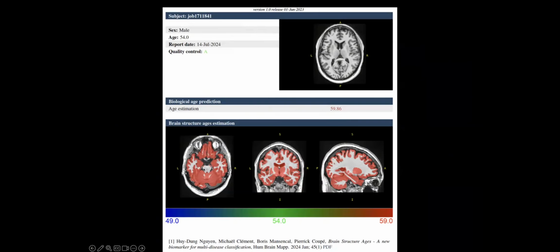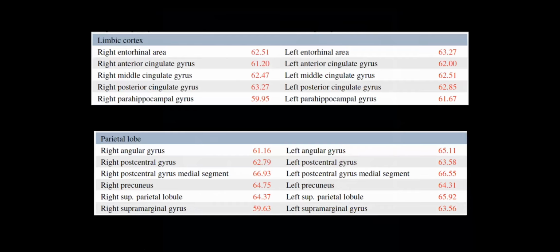And that's evidenced by these charts that show the brain segmented out with red colors, denoting all the parts of the brain that are abnormally aging. Again, this individual is 54 years old chronologically. If they had a brain age in alignment with their chronological age, all of this should be green. If they were younger than their chronological age, it could be blue. And because they're abnormally aging, it's all red. And that's a problem.